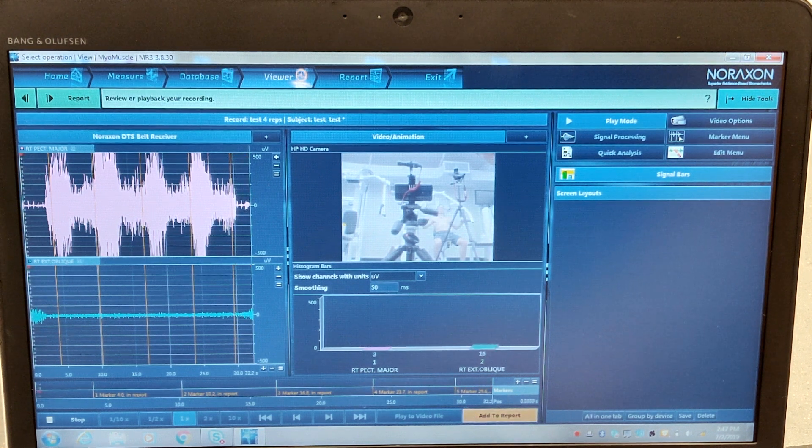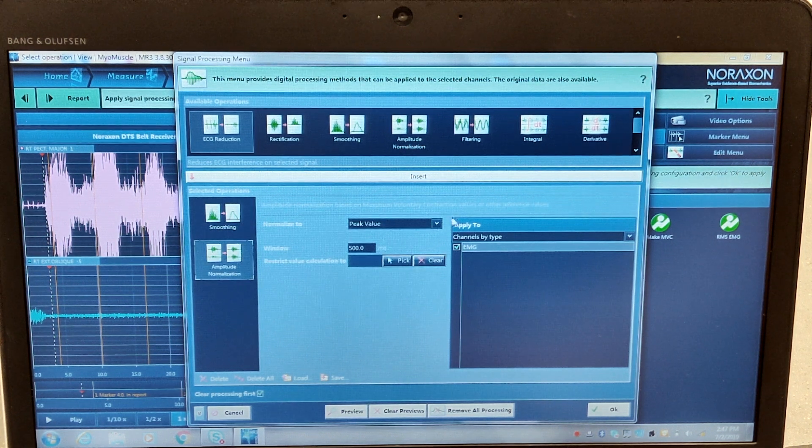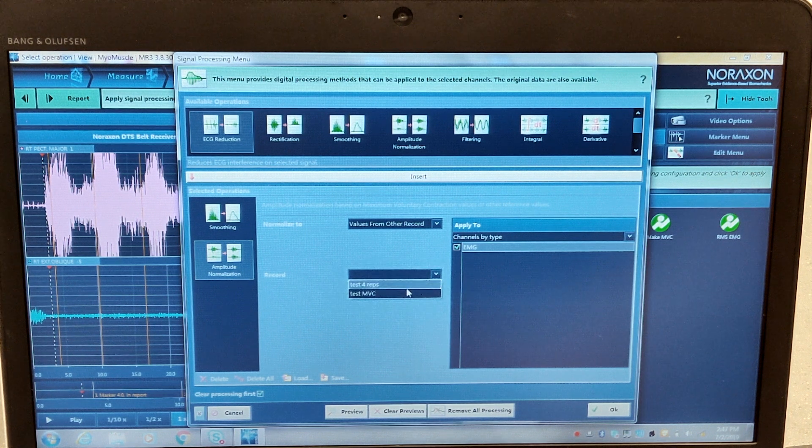Now we'll hit Stop on the bottom left and go ahead and process the signal. We'll hit Smoothing, the algorithm will be RMS at 50 milliseconds — that'll give us a nice clean signal. Then we'll go into Amplitude Normalization, hit Peak Value, and go into Values from Other Record. Because we have an MVC already, we're going to compare the muscle activation from the repetitions to the MVC. We select Test MVC and click OK.